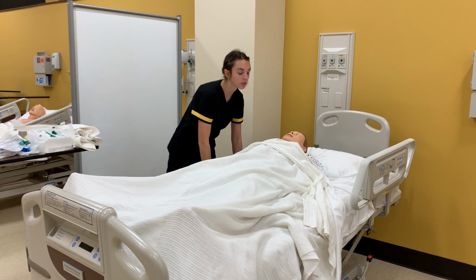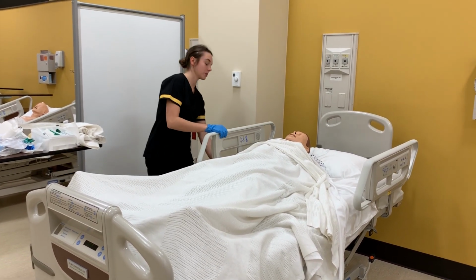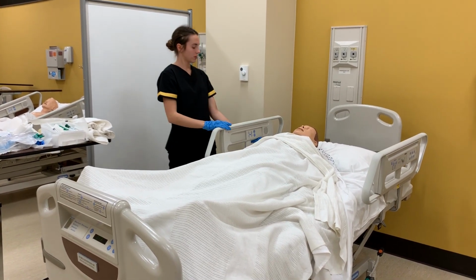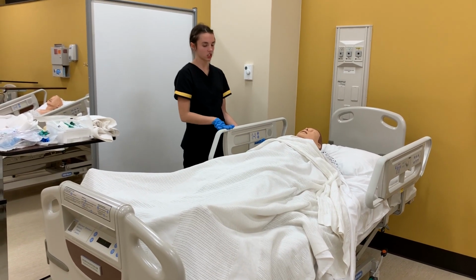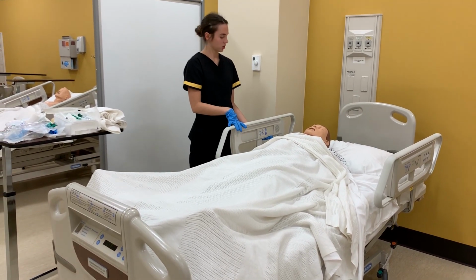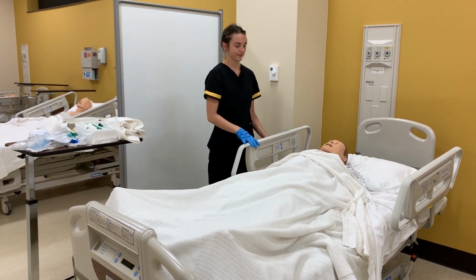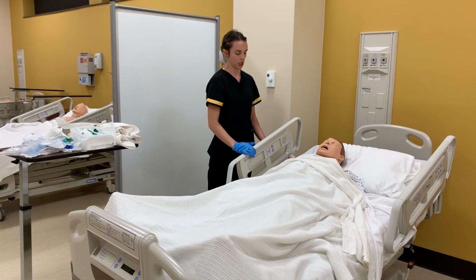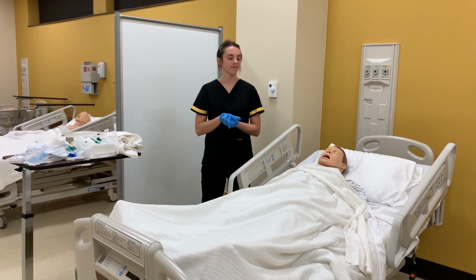The patient tolerated the procedure well, besides the balloon that I got to deflate, but we did. We made it through it. And so we would put the bed rails up by 2, put the bed in the lowest position before leaving the patient's room, and just get him comfortable. So nice. Mr. Benjamin, you did great. And I would now document the procedure, and that's all.